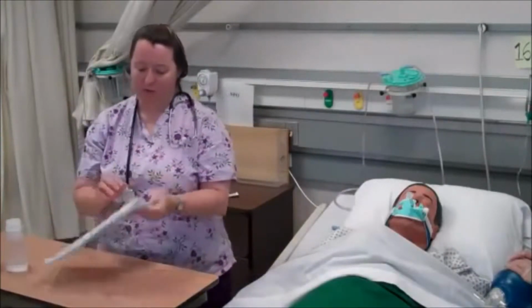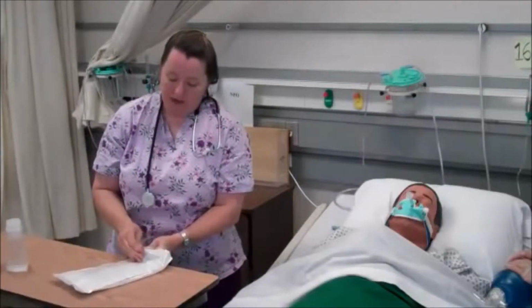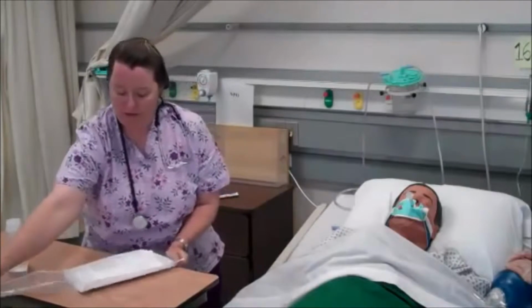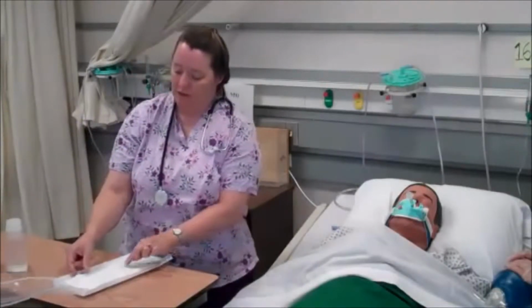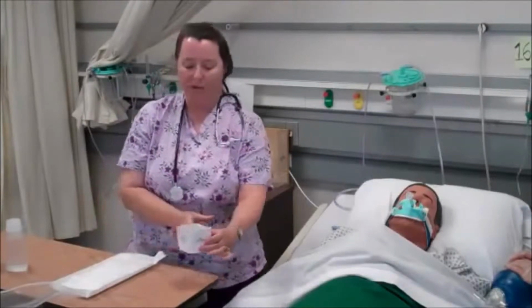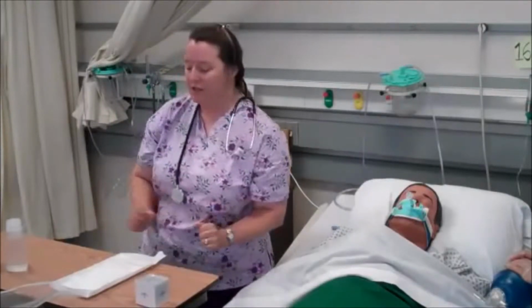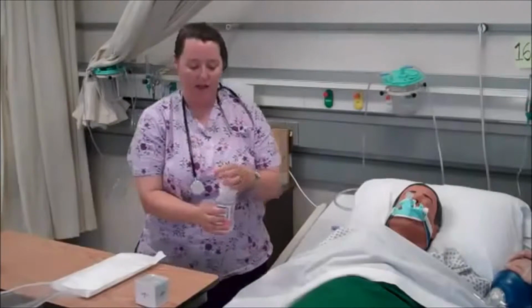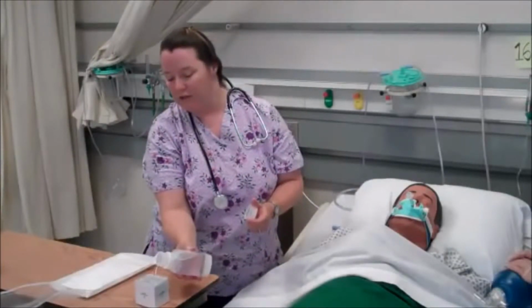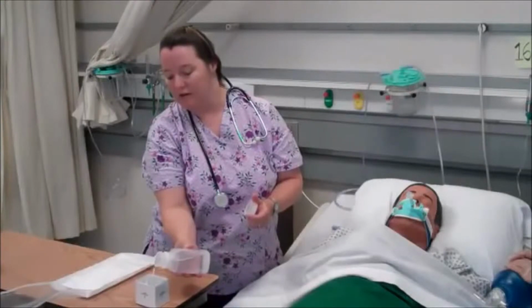And I'm going to get my equipment ready. Opening up any kind of packaging, making sure you open it up the right way. This kit comes with a little cup for the saline. I'm going to open it up. Sterile technique: I'm not going to touch the inside. I'm going to take my saline and pour it, not touching the fluid bottle to the cup there.